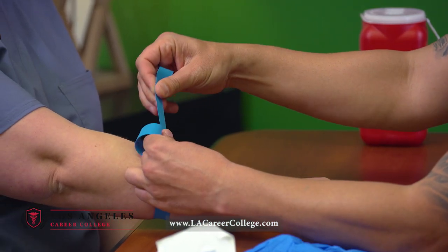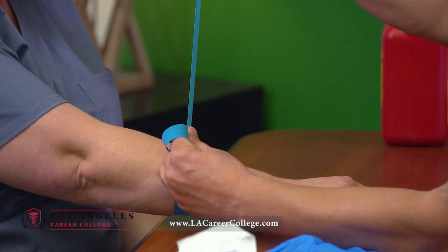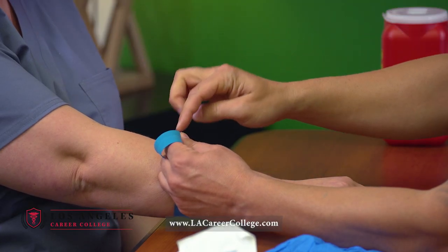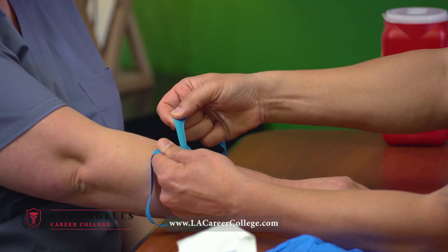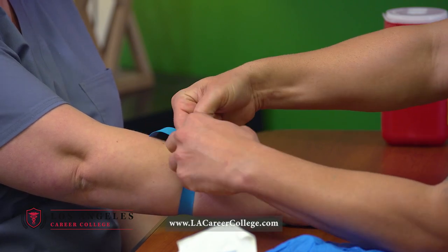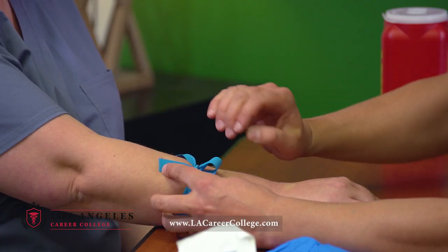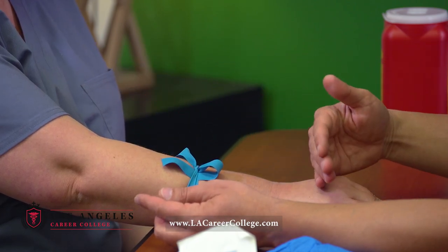What you want to do is hold on to your X — hold on one side while you're pulling on the other, and then the flap that's facing you gets tucked in. When you're tying your tourniquet, you have to be at least five fingers away from your IV site, and the flaps need to be away from your IV site so that you do not contaminate your possible site.